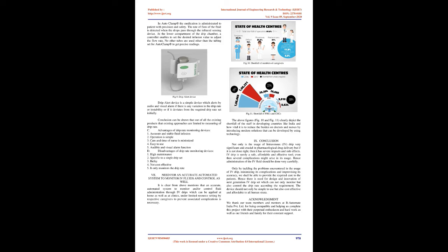They have used a combination of LED and phototransistor for monitoring the drip rate to provide an alarm. Various research groups have used methods other than optical sensing to monitor drips. These include capacitive sensing, piezoelectric sensing, ultrasonic sensing, and also a microwave time domain reflectometry sensor, which is applied to the side of the drip bottle/bag. Thus, existing approaches are limited to monitoring of drip rate.